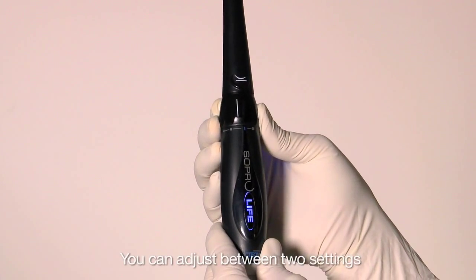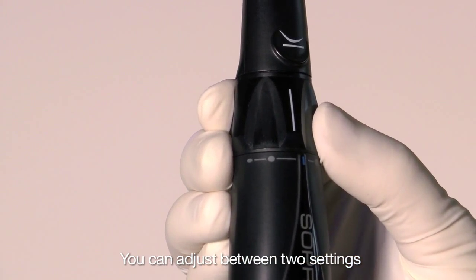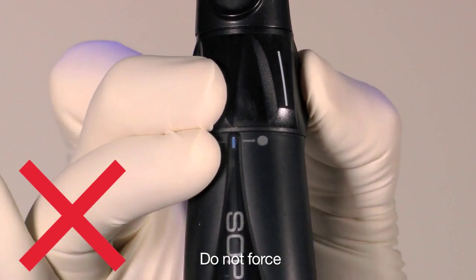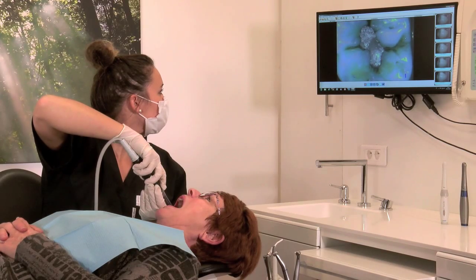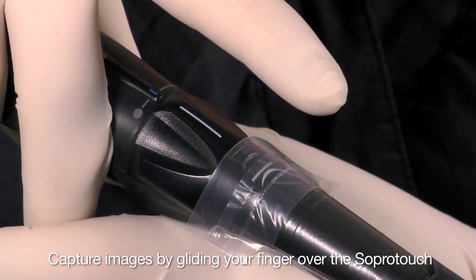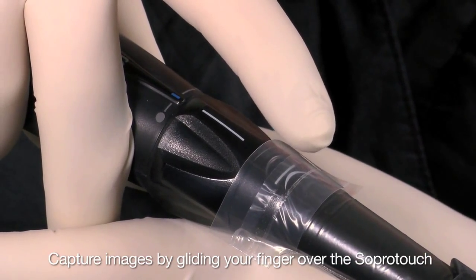You can adjust the focus by moving the focus ring. Do not force the focus ring past the end focus settings. When the image is clear, capture an image or video by gliding your finger over SOPRO's patented SOPRO touch or by using a foot pedal.